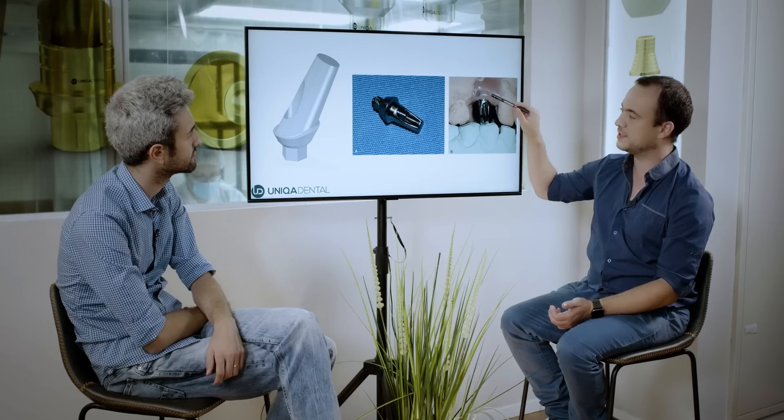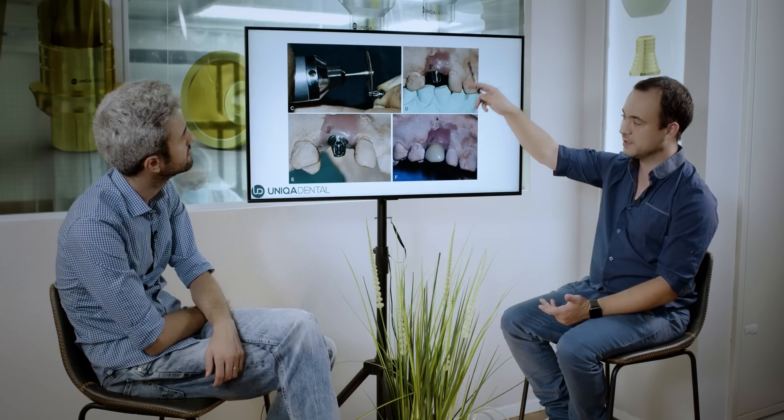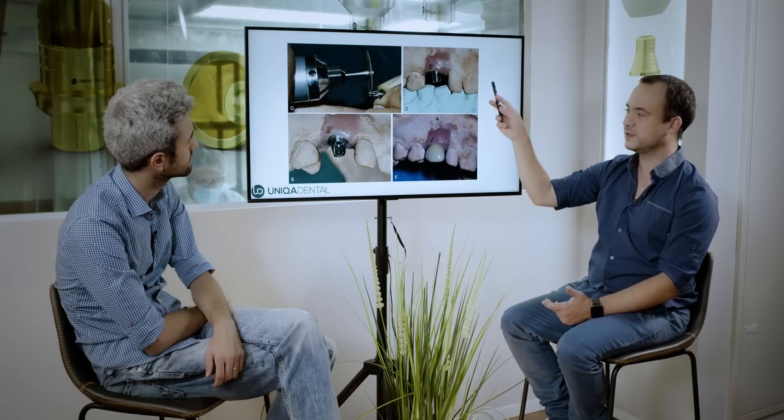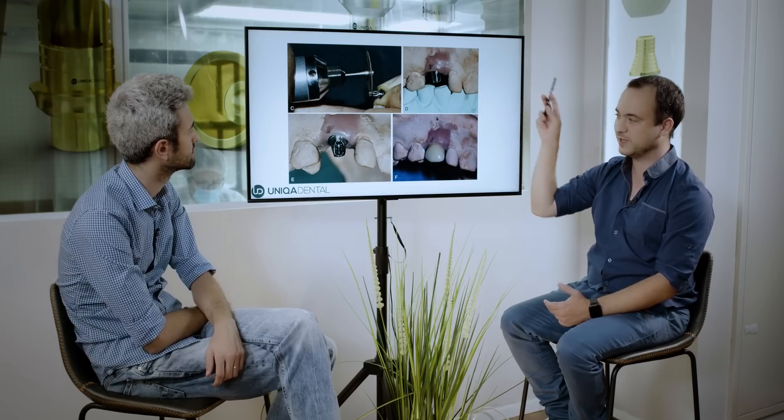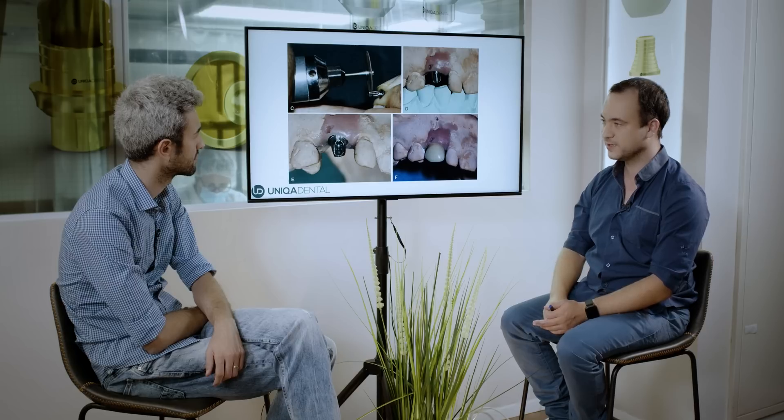So in this case we take a prefabricated abutment from the factory. The abutment fits the implant and comes in a much taller version. You can just cut the abutment and then by the design of the abutment you can make the crown itself. You measure the height of the abutment, process it a little bit, and then you make the crown.